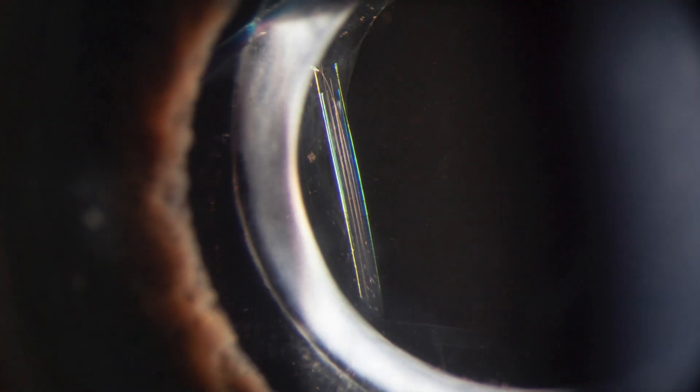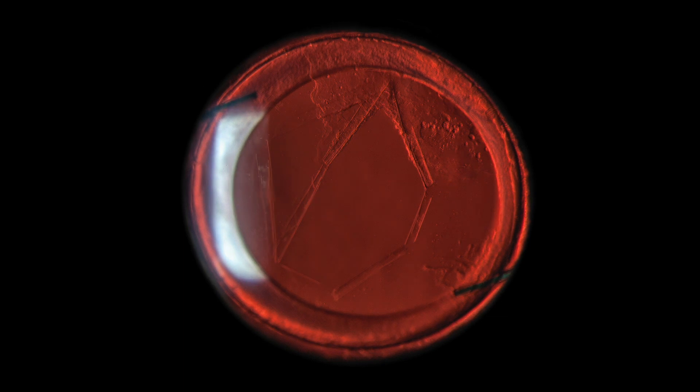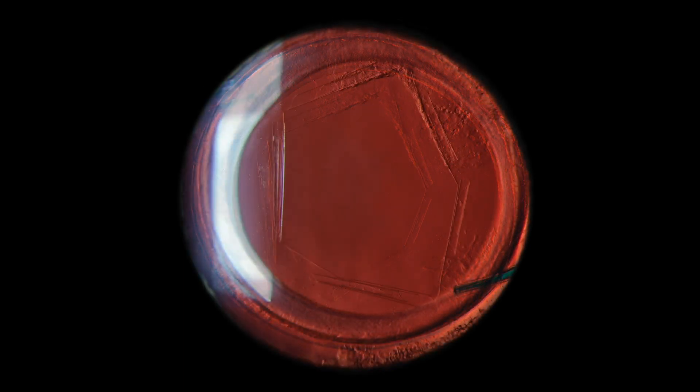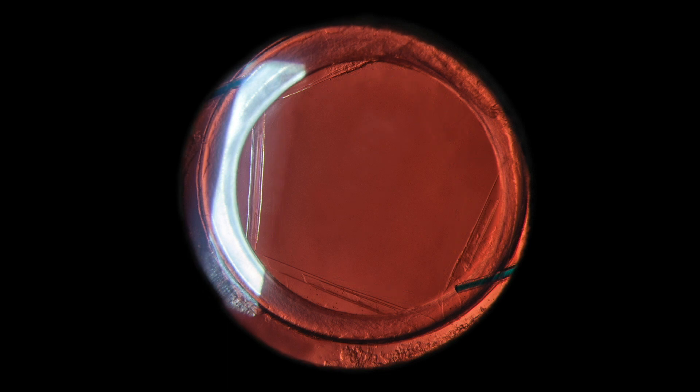This will result in clean and perfectly curled capsule edges. Assuming a perfectly sized rhexis without the risk of a vitreous prolapse into the anterior chamber, I try to achieve a posterior capsule opening between 5 and 6 millimeters.